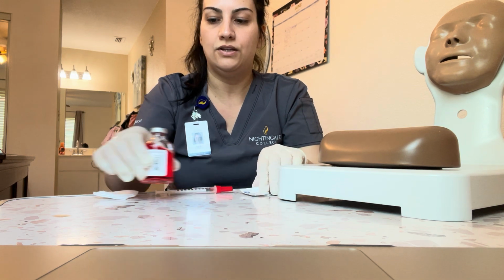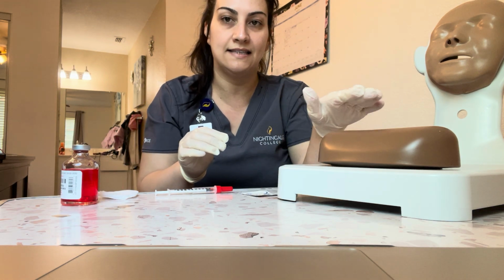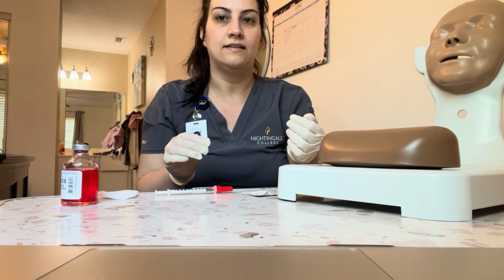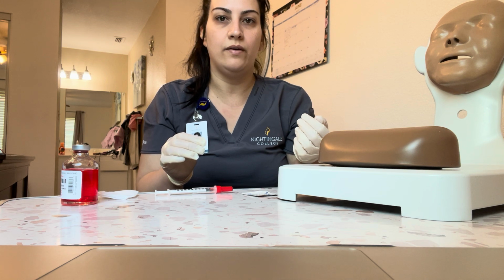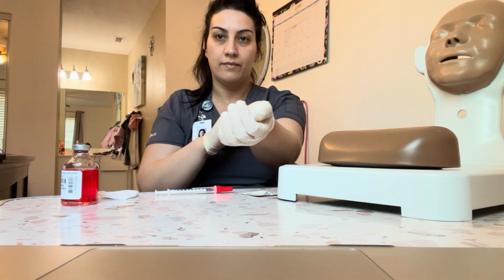Next, we're going to assess the site and clean it. The injection could be given at the upper arm, both forearms, or in the upper back. This time we're going to be giving our patient the injection in the forearm here.